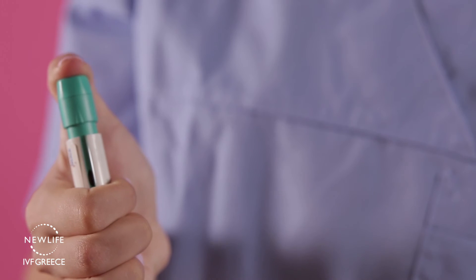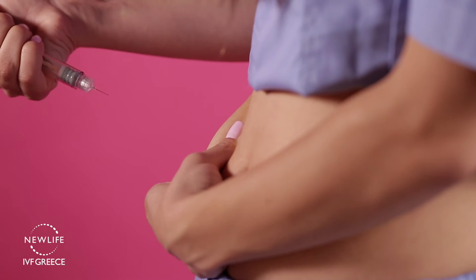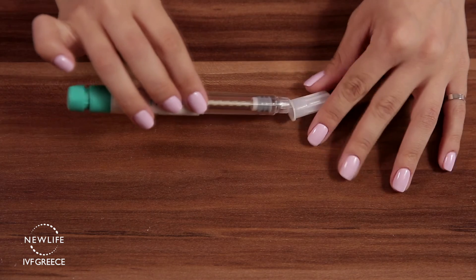Push the dose setting knob as far as it will go, steadily and without stopping. Take the needle out of the skin and with your cotton pad or swab massage the area for 2 seconds to disperse the medication evenly.